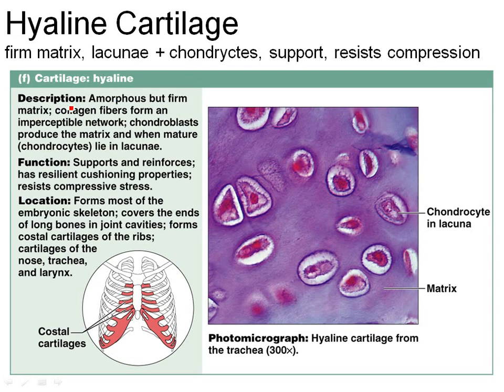Now we enter the world of cartilage. When you get into cartilage, you're now dealing with a matrix that's so thick and dense, you can no longer simply dissolve cells into it. So now you need a hole for the cell to sit in. The holes are called lacunae. And remember, now we're dealing with chondros. So this is a pretty mature cartilage, so it would be chondrocytes.